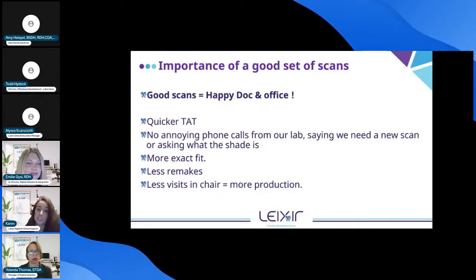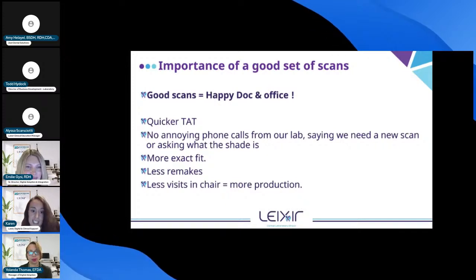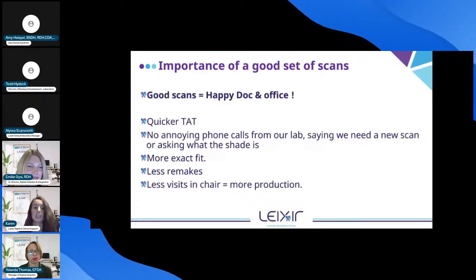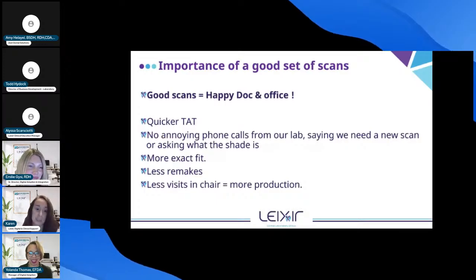So, the importance of a good scan. I think we all know good scans mean a happy doc, a happy office, quicker turnaround time, and fewer phone calls from our lab saying, hey, we need a whole new scan. You know, the palate's missing on here. Oh, by the way, what's the shade? If you give us good scans right off the bat, you won't hear from us. We will make what you need and ship it out the door ASAP.